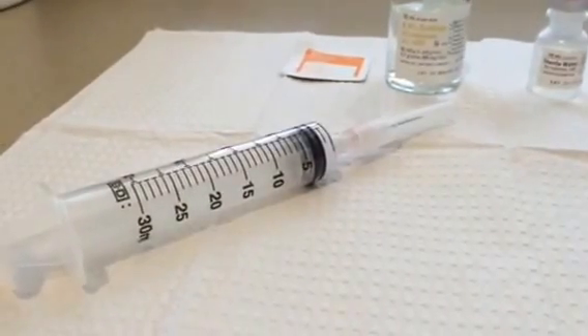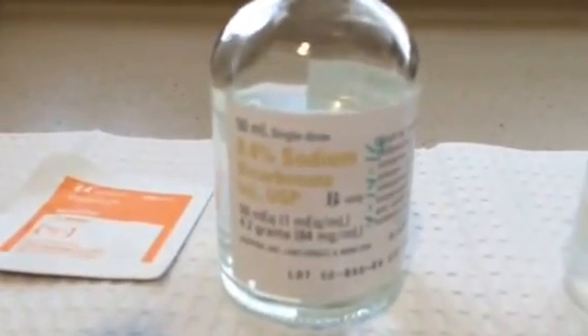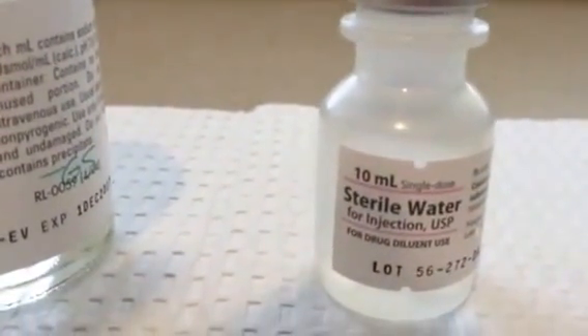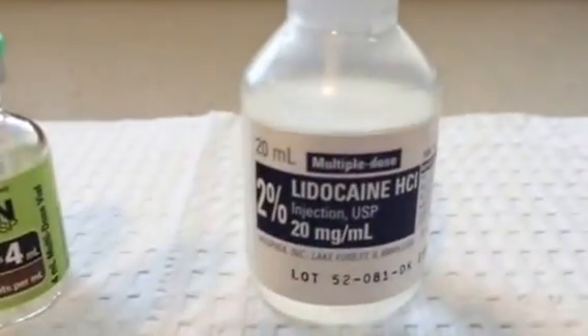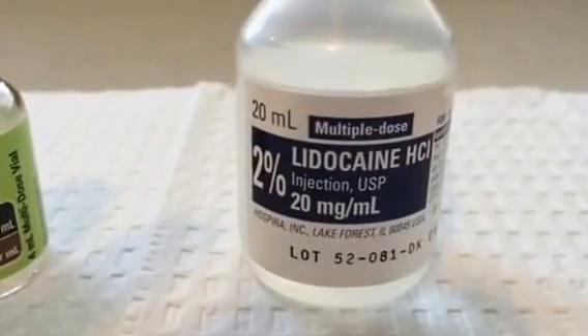To prepare a bladder instillation, the following items are needed: a 30 cc syringe with an 18 gauge needle, sodium bicarbonate 8.4% solution — 3 cc's of that, approximately 5 cc's of sterile water, 40,000 units of heparin, and 10 cc's of 2% lidocaine, which is 200 milligrams of lidocaine.